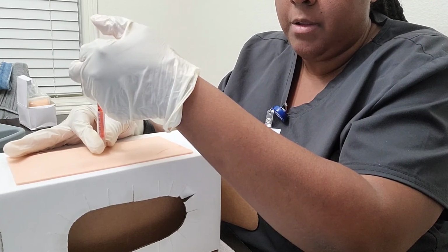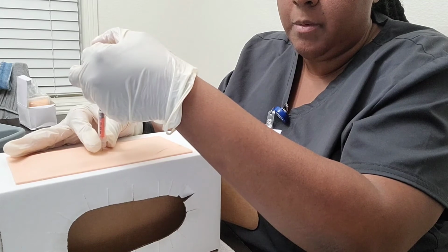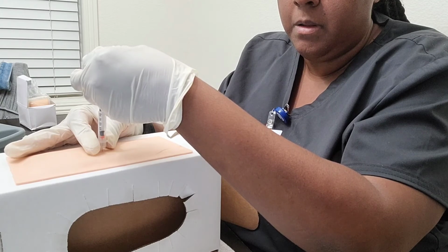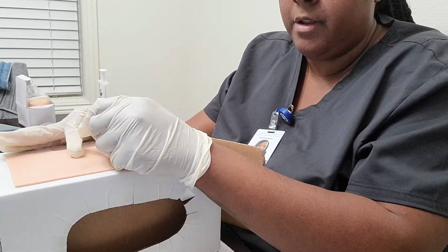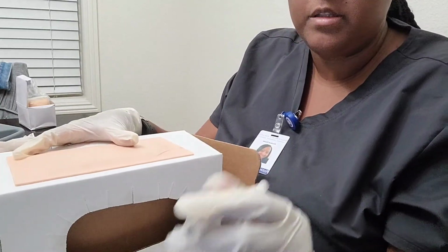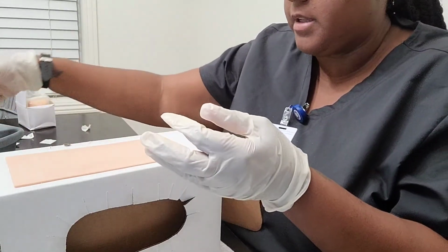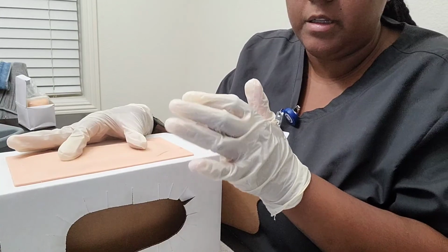But I'll go ahead and now, once the medication is injected, and I'm going slowly, I will go ahead and smoothly and steadily withdraw the needle and release the skin. I'm going to go ahead and throw this into, I'm not going to cap it. I'm going to discard this into a sharp container. I'm not going to recap it.